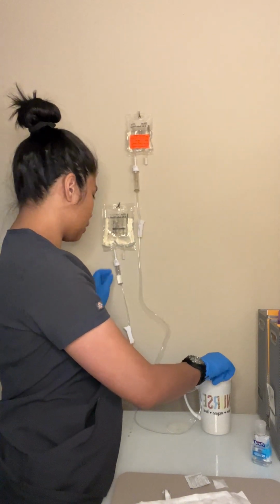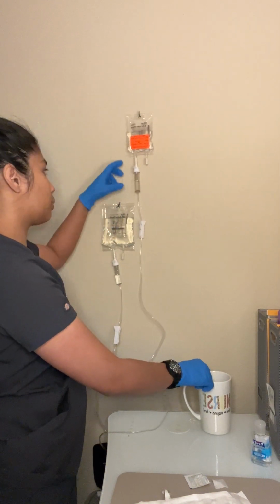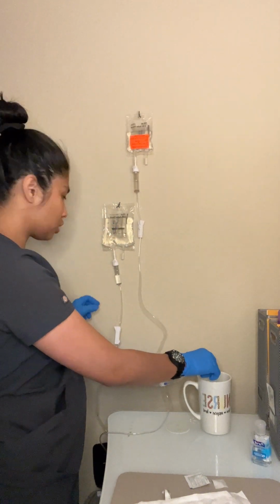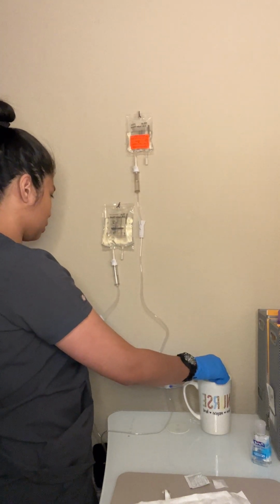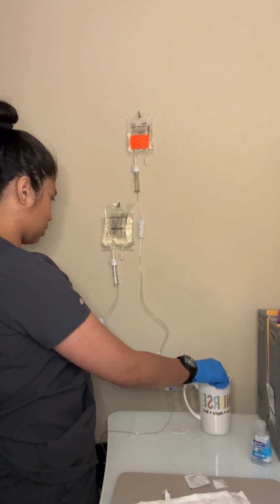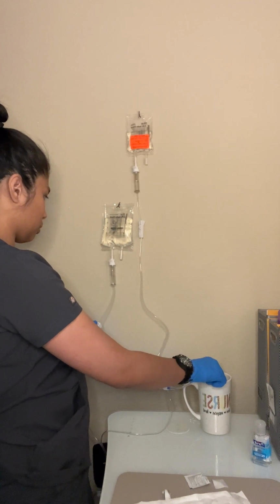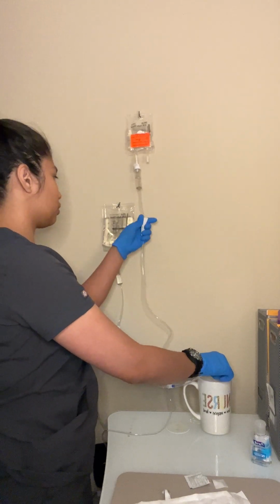Full minute. So, obviously the drop for the medication would be faster compared to the drop of the primary line. So the clamp is pulled off.